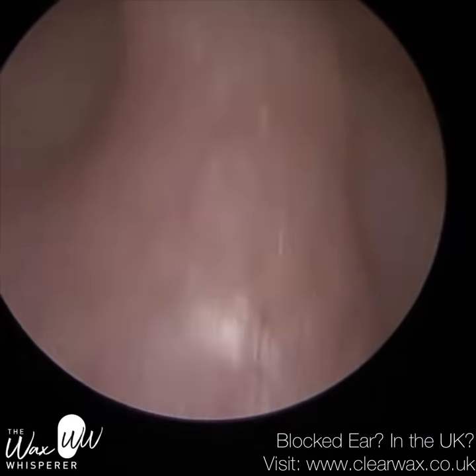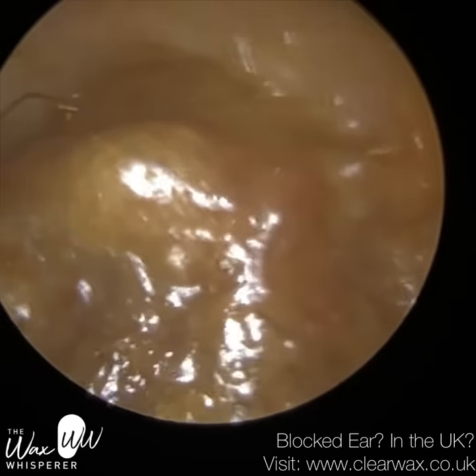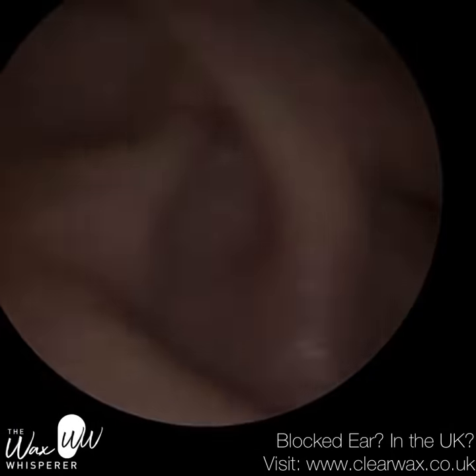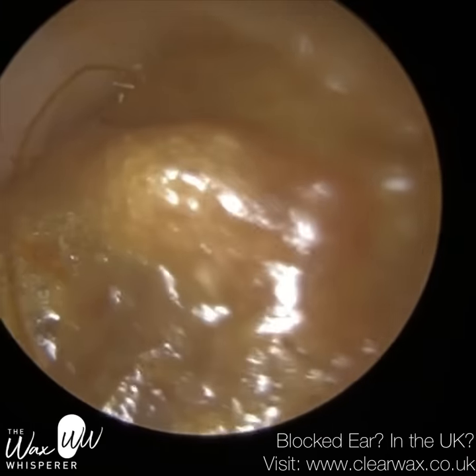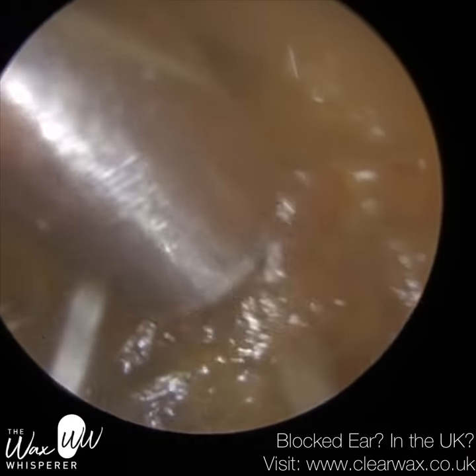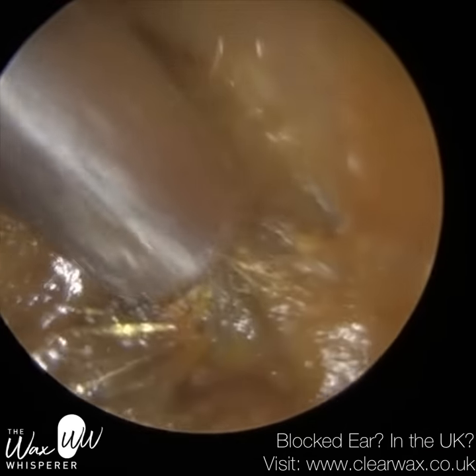So this is their right ear. Although this ear the patient felt wasn't as bad as the left ear, in terms of removal, it's a bit more tricky. I said they've been using some drops here at the surface. I asked them which drops, I wasn't sure, but I suspect it's hydrogen peroxide.